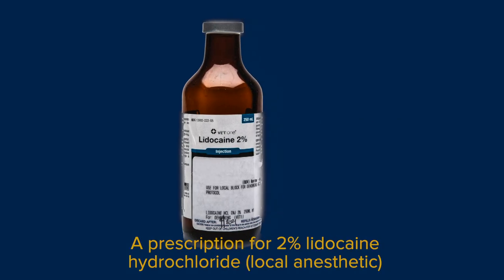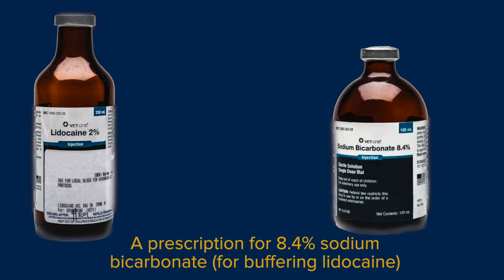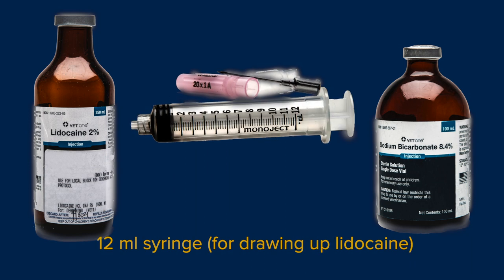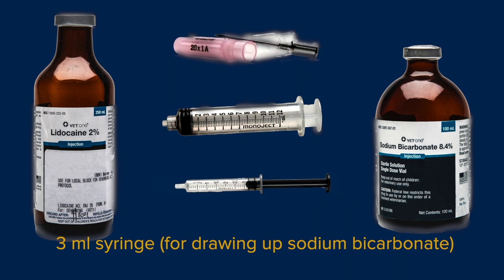To give a nerve block with local anesthetic, you will need prescriptions for 2% lidocaine hydrochloride and 8.4% sodium bicarbonate, 3 to 5 twenty-gauge 1-inch needles, a 12 milliliter syringe for drawing up the lidocaine, and a 3 milliliter syringe for drawing up the sodium bicarbonate.